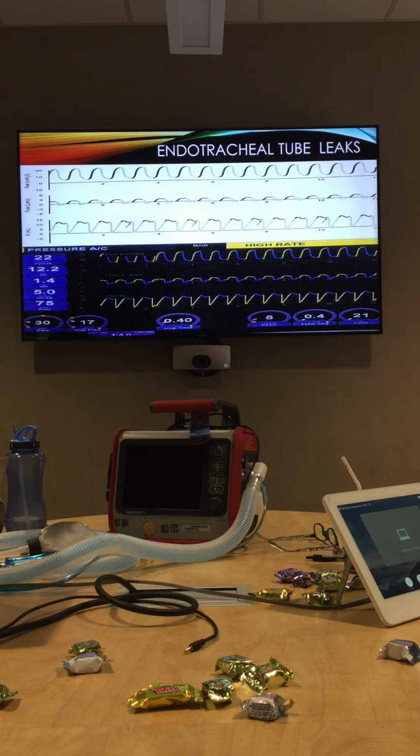One of the things that actually does help ventilator synchrony is keeping those triggers exactly where you need them to be. You can adjust that a little bit by looking at your leak percentage. The Hamilton will actually show you a leak percentage, so you can somewhat use that as an additive to help you with that. Same thing with endotracheal tube leaks.